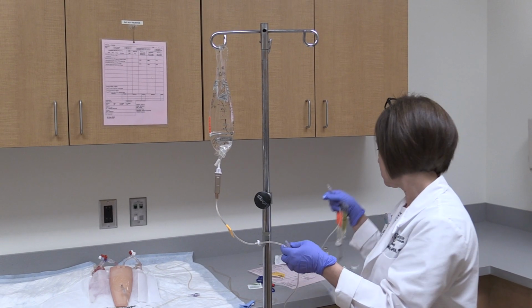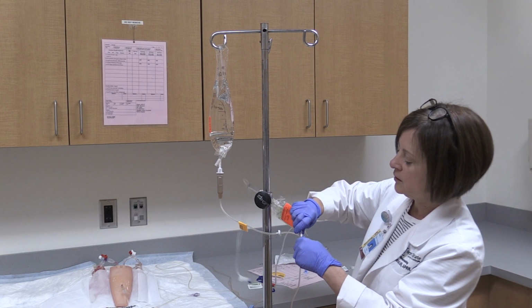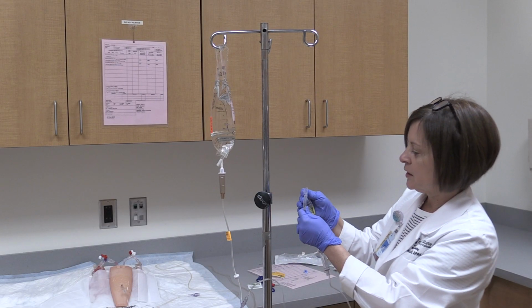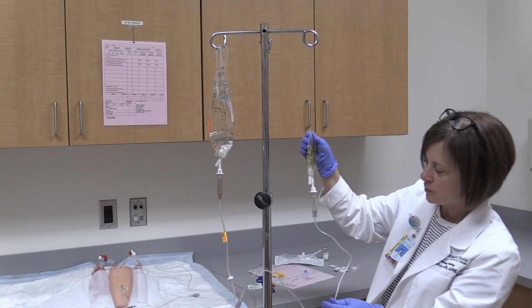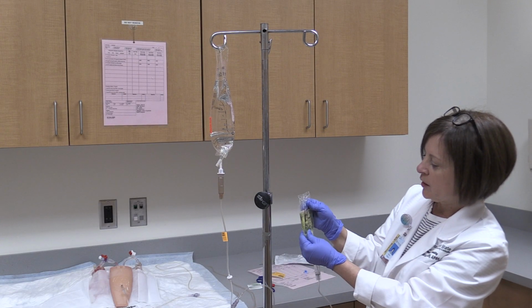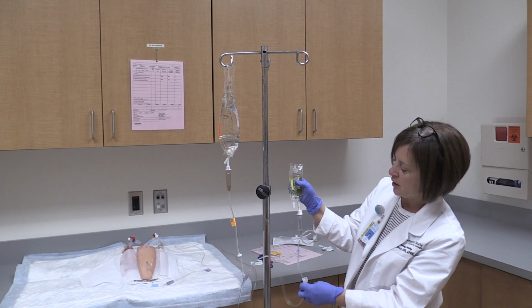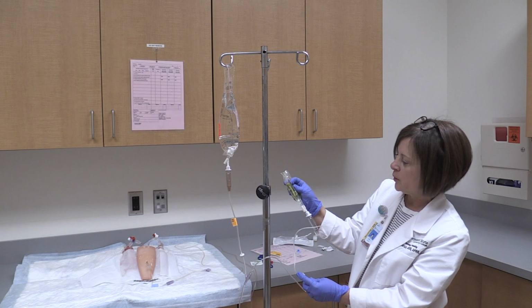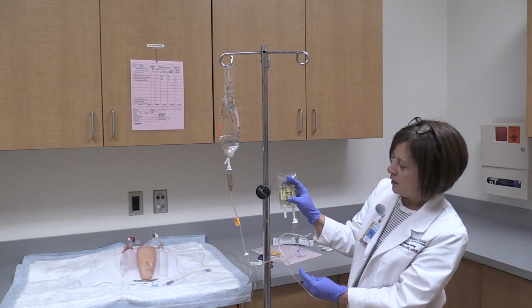I can unhook this and put that in, kind of push and turn. And then at this time, so that I can back prime it to fill this, because there's air in here and we don't want that, I'm going to keep this bag lower, and I'm going to very carefully unclamp my secondary tubing. You don't want to do too much because it will fill quickly and then you'll ruin the concentration that you already have in the bag.